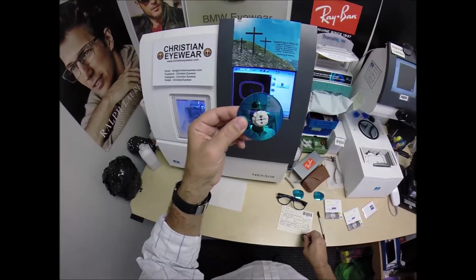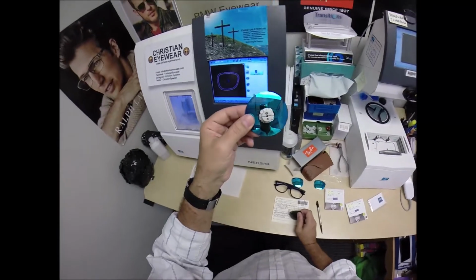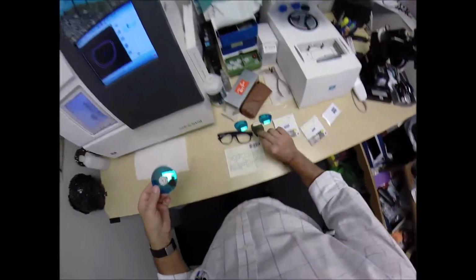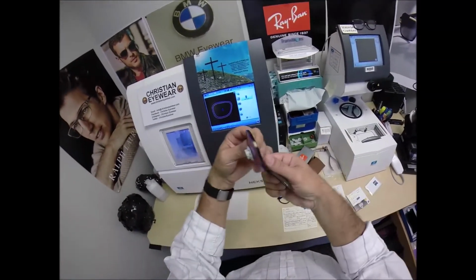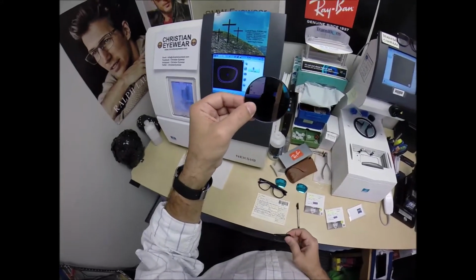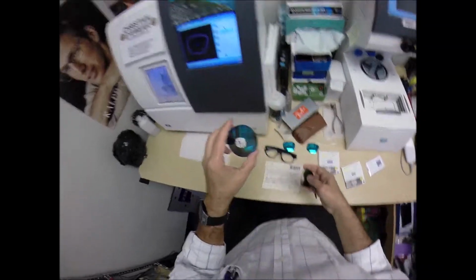Polarized, again, are like horizontal Venetian blinds for your lenses. The same way you can skip a stone off of water, light does the same thing. It hits a flat surface and reflects back up. So, polarized lenses stop reflections off of water, originally, which is what they were designed for, but also off of roads, bumpers, windshields, things like that.